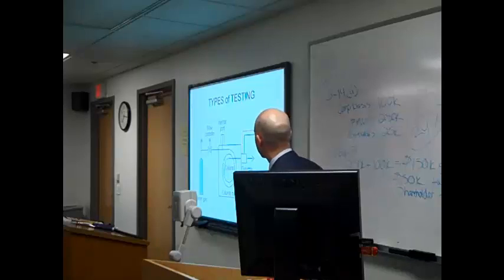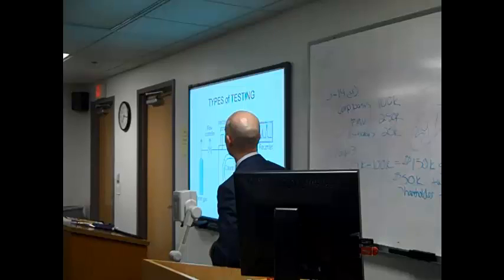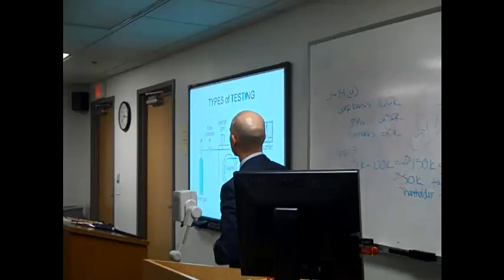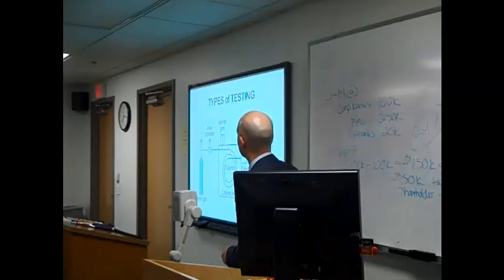So here's the device, the internal components. You would inject the gas here, and then there's a gas that pushes it through what's called a column. I'll show you that in a moment. It goes out of the machine. There's a flame ionization detector, which burns it up, and then essentially records at what time it's coming out of the machine and how much of that compound is there. And then it goes to the computer, and the computer produces what's called a chromatogram, and you look at that, and it gives you the numbers and tells you what the compound is.